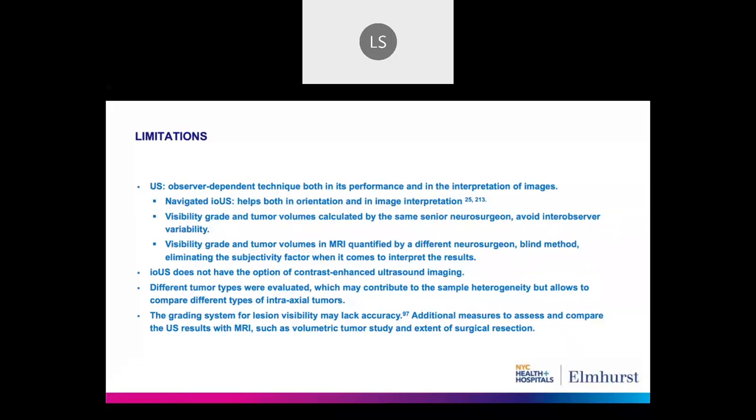And also, we didn't have the contrast enhanced ultrasound imaging that, as I said, is available for neurosurgery, but not many centers have it. And we were also comparing intraaxial tumors, but there were different types of intraaxial tumors, which allows us to compare them between them, but it adds heterogeneity to the sample, right?